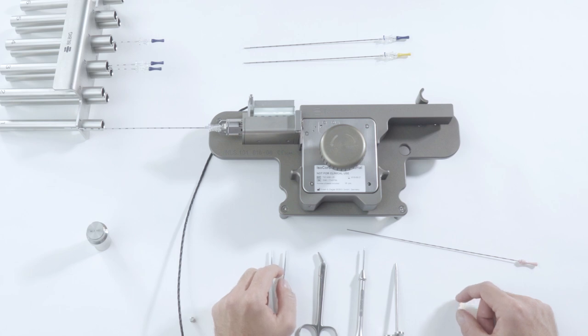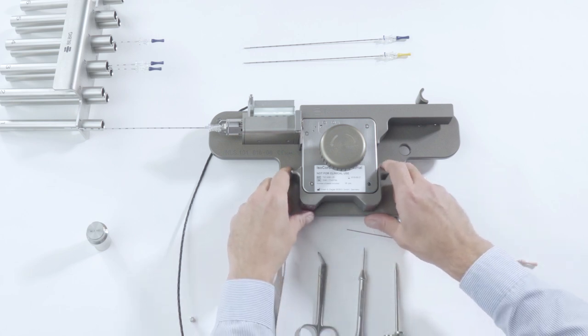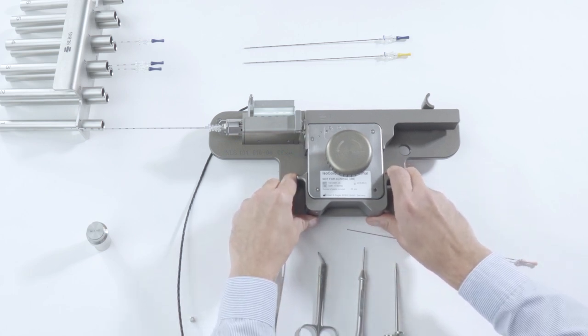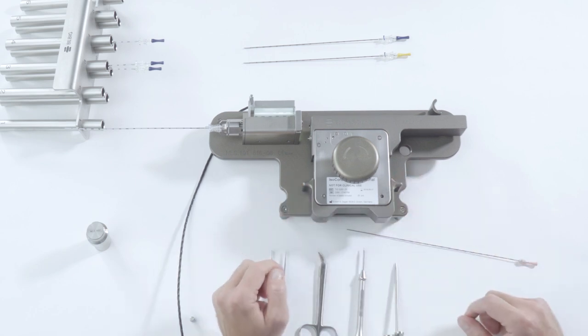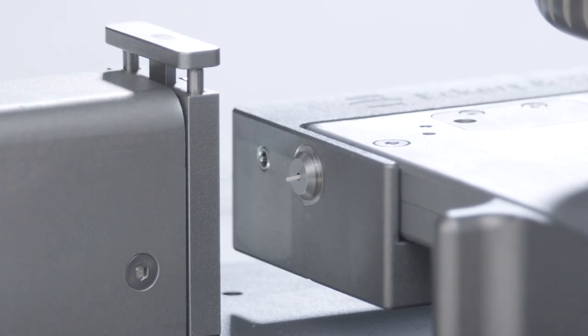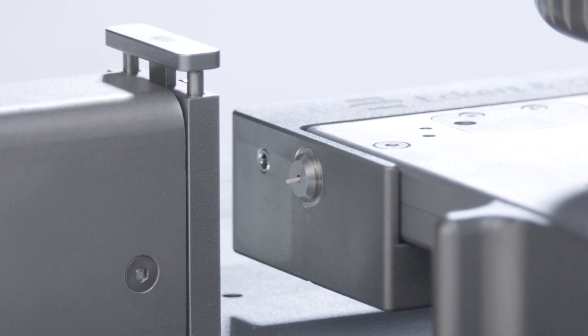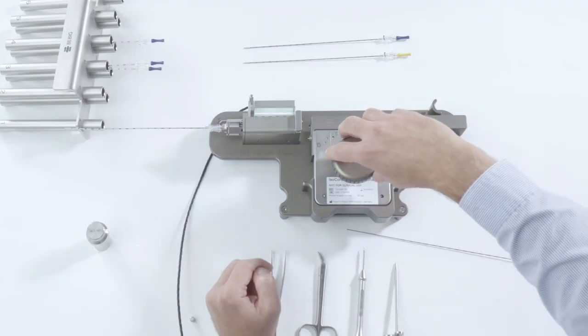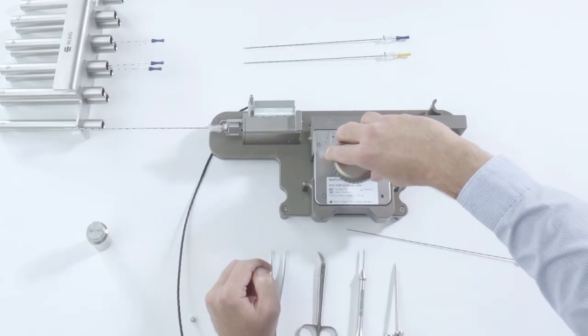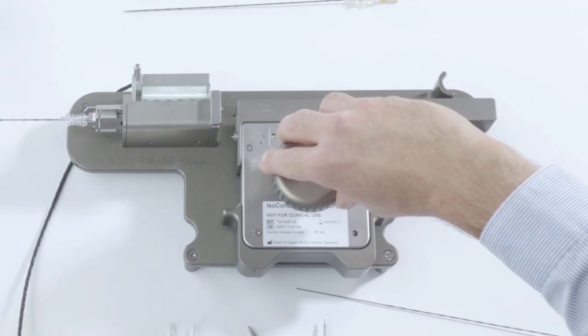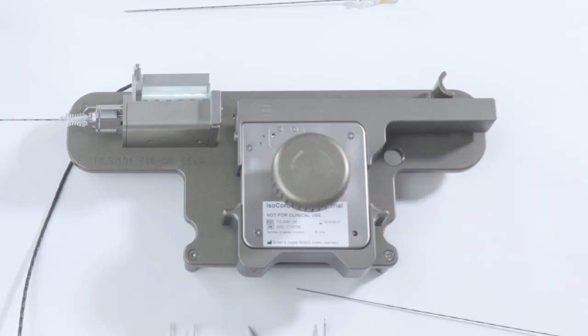Next, use the handles on the magazine holder to move it from the isocord position to the mandrel position. If done correctly, a half spacer will protrude from the socket on the magazine holder. Turn the knob in the direction marked magazine until the end of the seed chain is flush with the socket on the magazine holder.